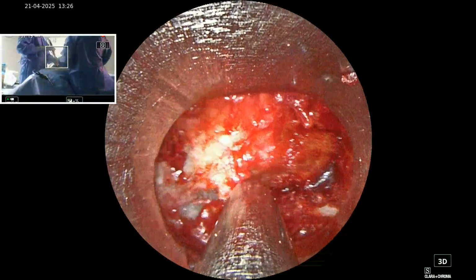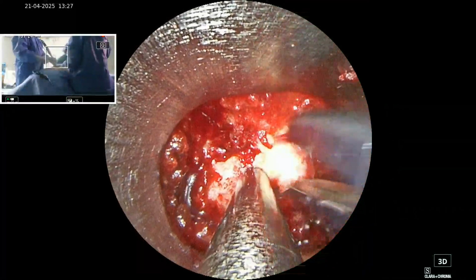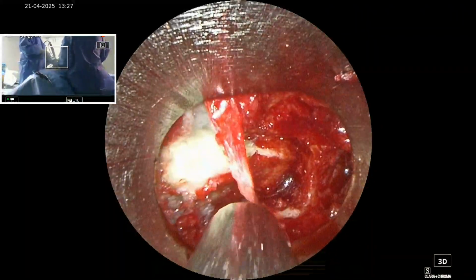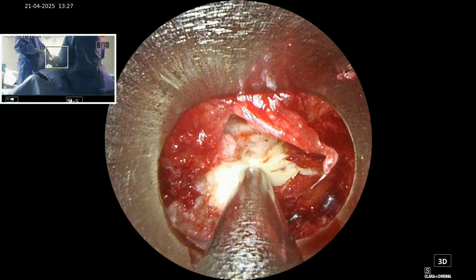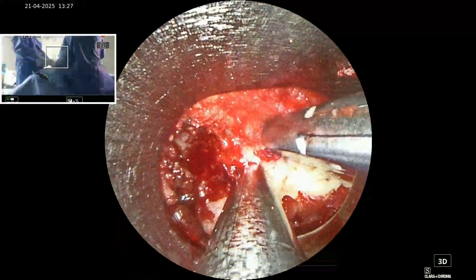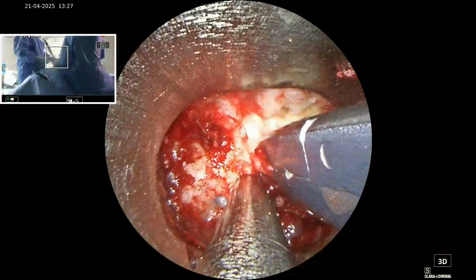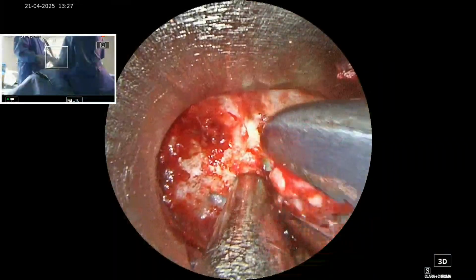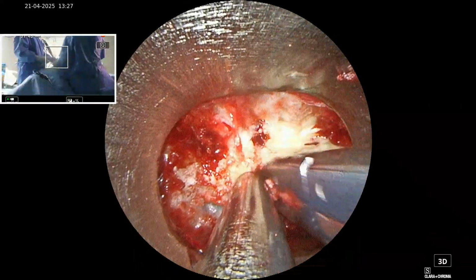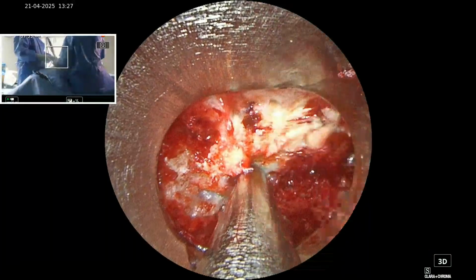Now we'll go for the inferior lamina and we'll check the demarcation of the soft tissue to the bone attachment. These are the superior layer, the superficial layer of the flavum. The yellow ligament looks very nice, yellow structure. Now we'll go to the deep layer, and we will see the demarcation of the attachment of the deep layer to the bone here, very nicely cleared.